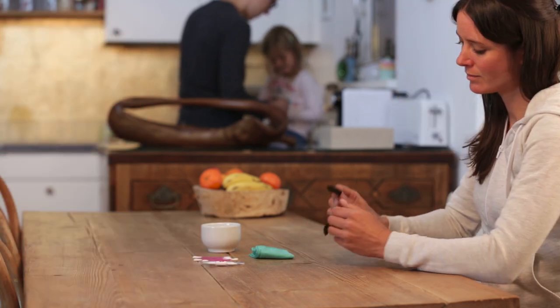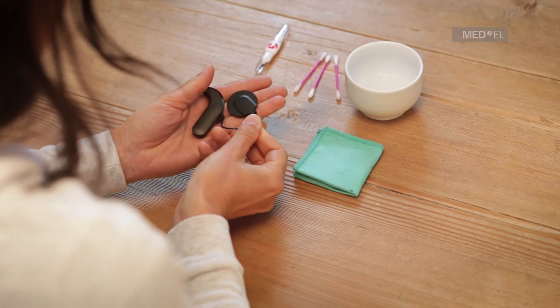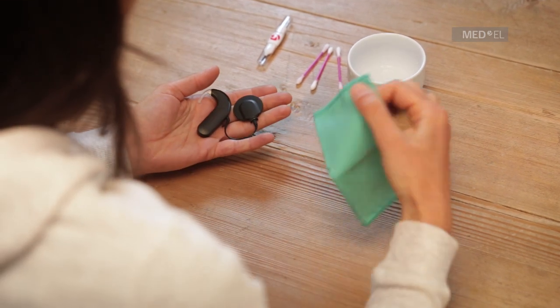By following a few basic and important care instructions, you can help improve the functioning of your Sonnet and extend its life.